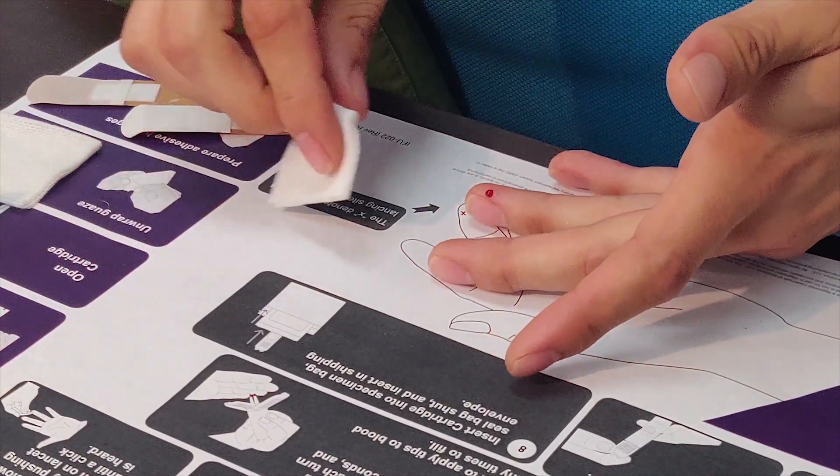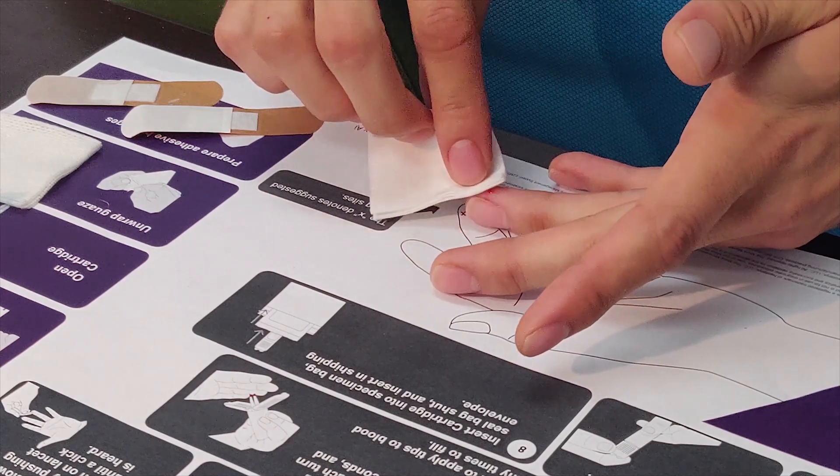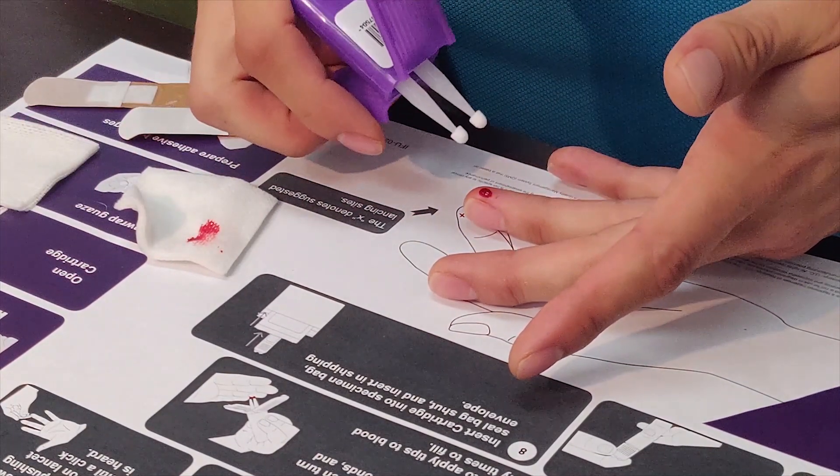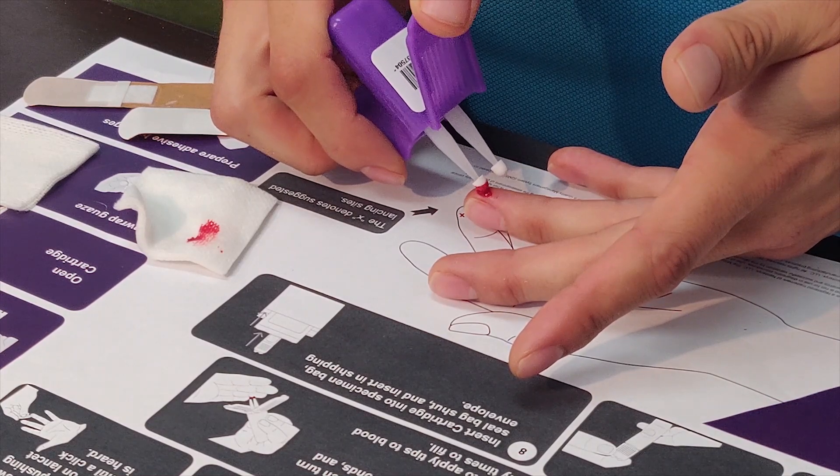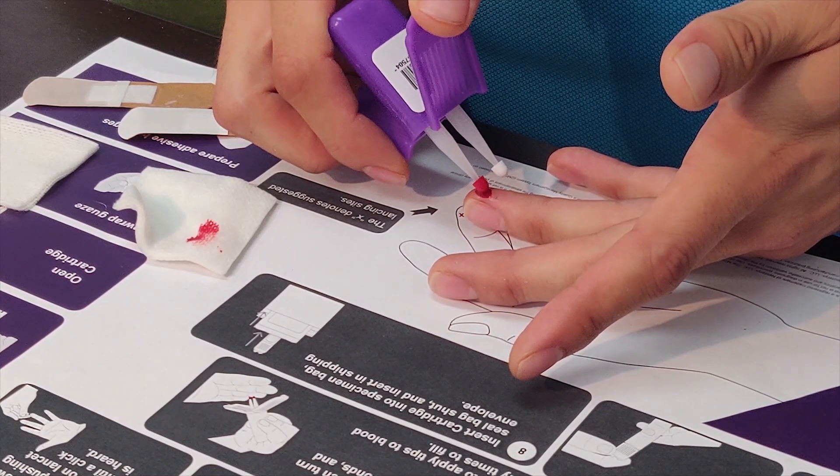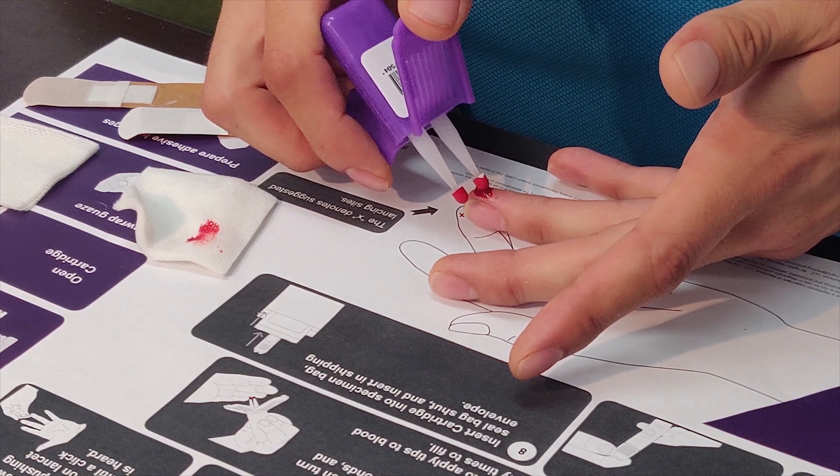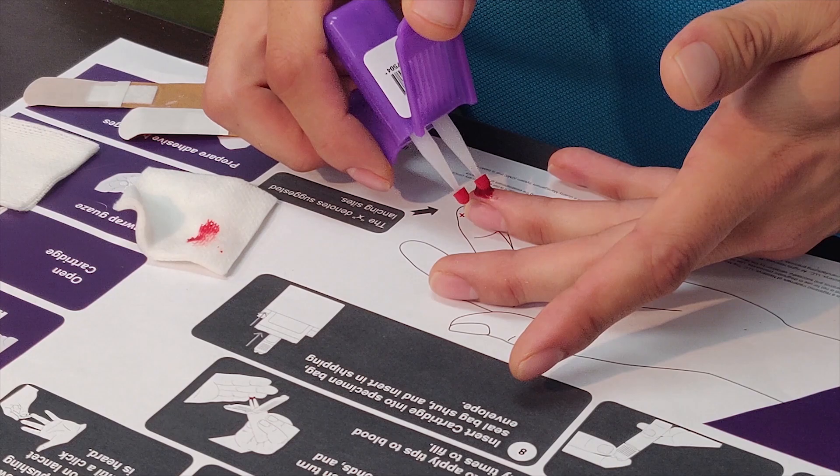Wipe away the first drop of blood with the gauze. Allow a second drop of blood to form. Apply the first sampling tip to the blood drop. Watch the sampling tip turn completely red and then count two seconds. Gently remove the sampler and apply the second sampler tip until it's fully red also.